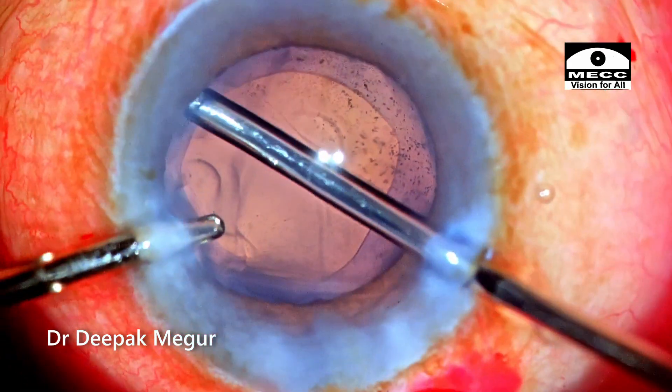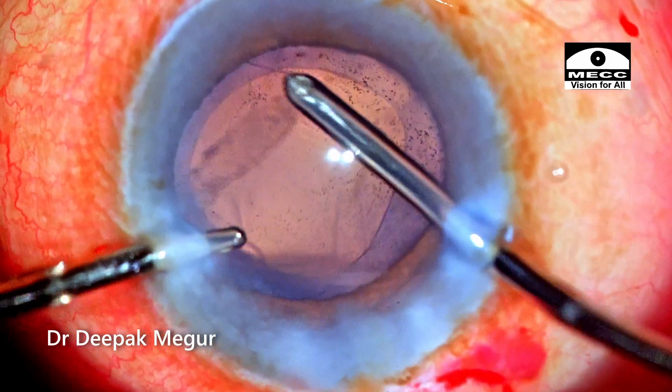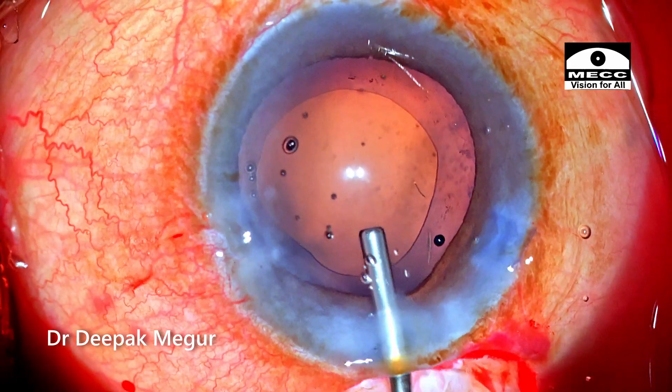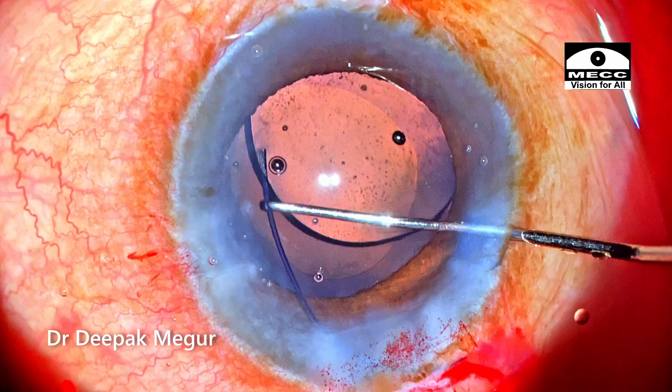There is hardly any cortex; I'm just irrigating it out. The visibility is slightly hazy because of the milky cortex mixed with viscoelastic coating the endothelium, but it washes out. Time to implant the lens — the rest is going to be the usual routine.